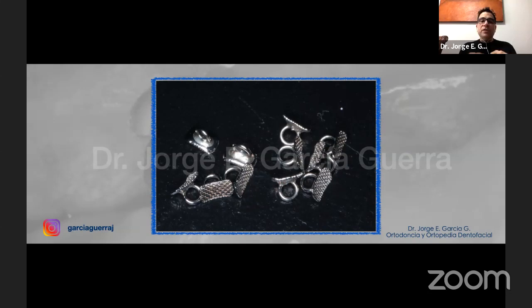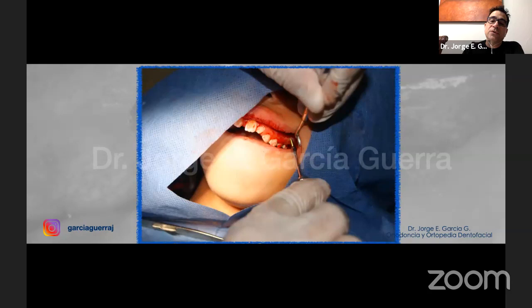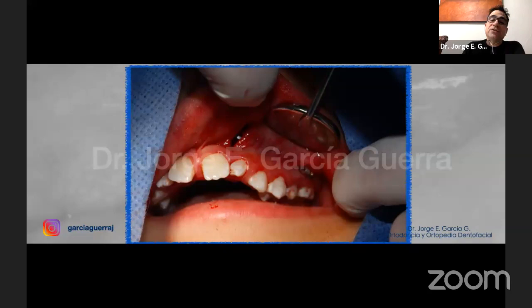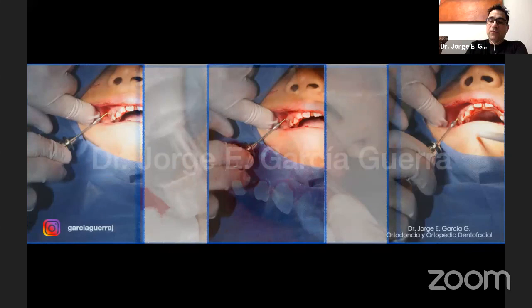Now you can see the sequence of the pictures, how as we put the implant in the mouth of the patient, we start to incline it. Okay, and there it goes. That's the one on the canine. Now what we're going to do in every appointment, we're going to cut the chain and start to activate it. So the canine starts to move away from the roots of the central and lateral incisor. Okay, that's the one on the right, and we did the same on the left. You can see how we're going to move the instrument as we insert it there.